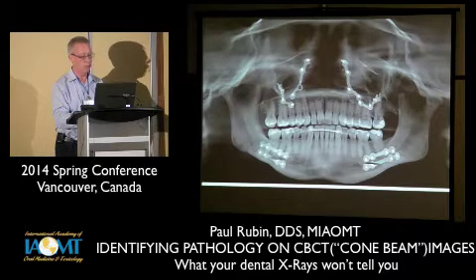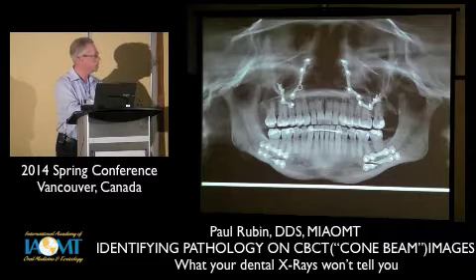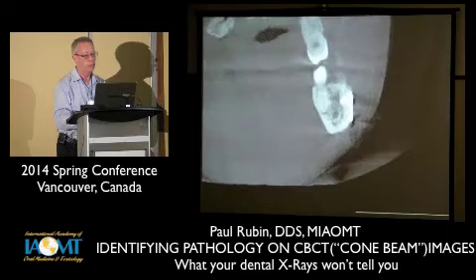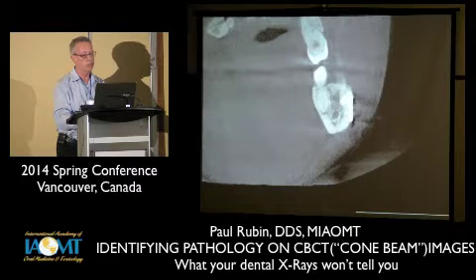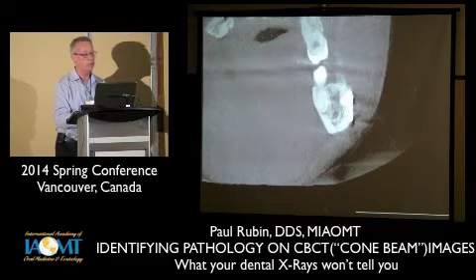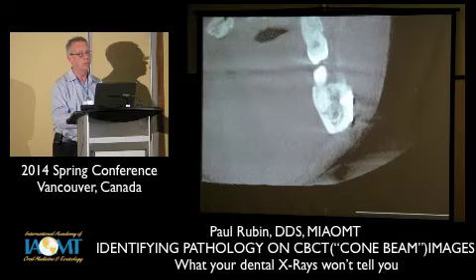I think if you're going to go in there and take that out, you might want to know where these plates are exactly. So this is just one of the cross-sectional views that shows, here's part of the root of that tooth. Here's the plate. It's all on the buccal bone. You can see how far in that screw goes. You can see the mandibular canal. A lot safer surgical planning when you can see this kind of information.